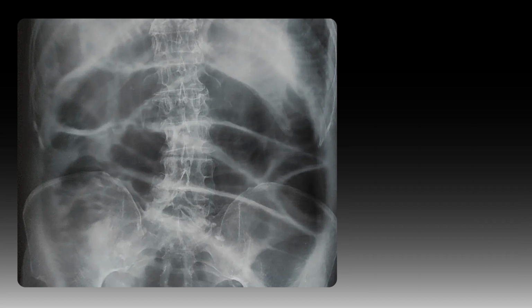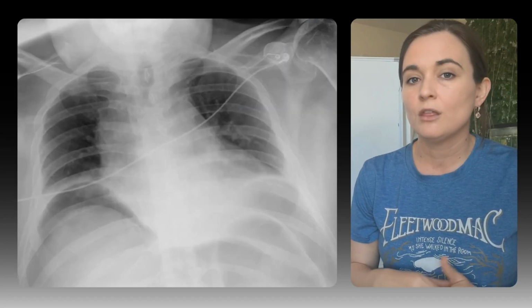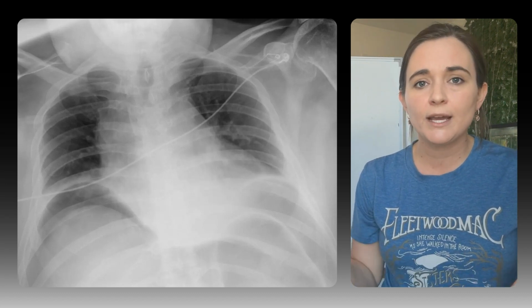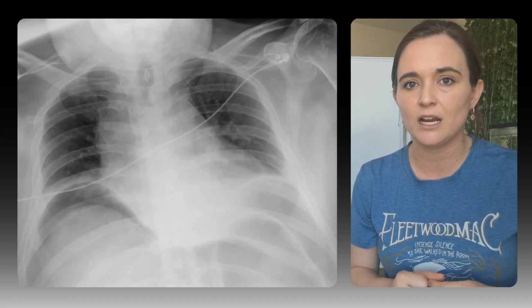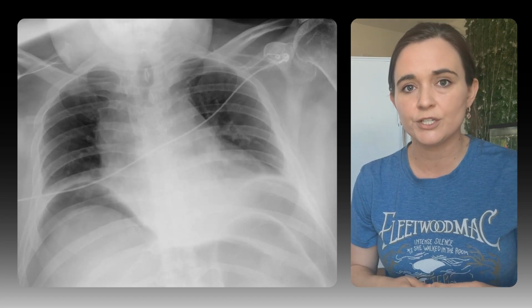Diagnosis? Small bowel obstruction. Now imagine a second patient, 30 years old, walks in holding his stomach, sudden pain like a stab. His upright x-ray shows a small, thin, black crescent under the right diaphragm. That's free air. He has a perforated ulcer. It's time to call a surgeon.